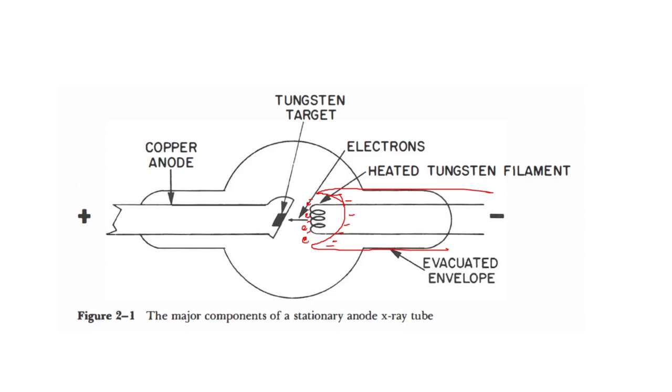When the electrons are released, they are repelled by the focusing cup. As a result, instead of flowing away from each other, the electrons converge, and all of them are focused onto the metal target anode. The focusing cup is made of nickel, and it is designed so that the electrons flow in a single proper stream and are accelerated from cathode to anode in the required size and shape.